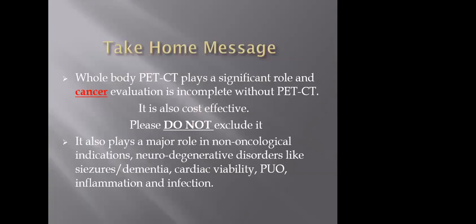So the take-home message is that the whole body PET CT plays a significant role in cancer evaluation, and the cancer evaluation is incomplete without PET CT. It is also extremely cost effective. It can be used as a one-stop evaluation and should not be excluded from cancer workup.